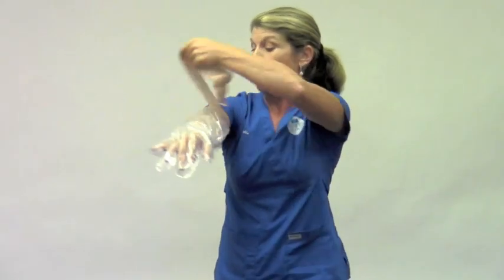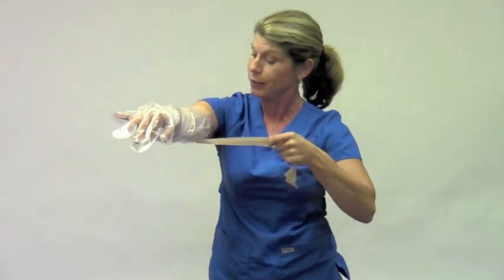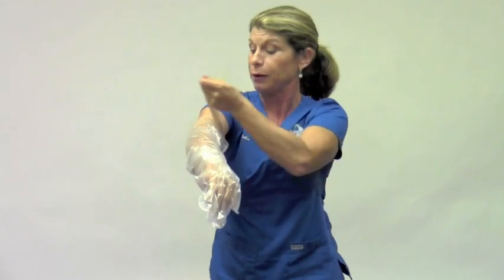Then you wrap, making sure the strap covers the top of the plastic as the water barrier. You pull and wrap, and when you're finished, you squeeze.